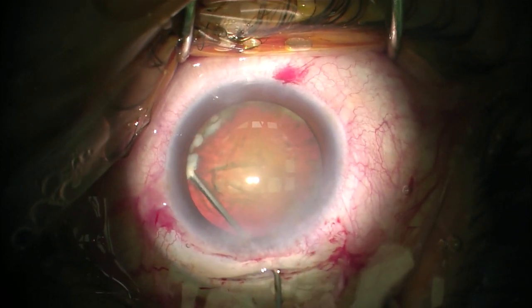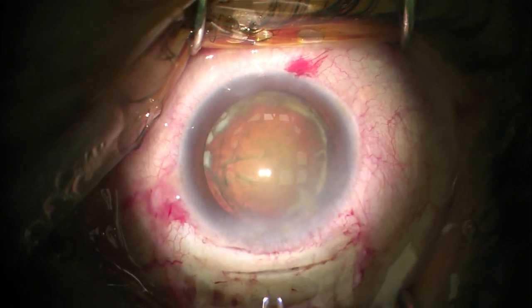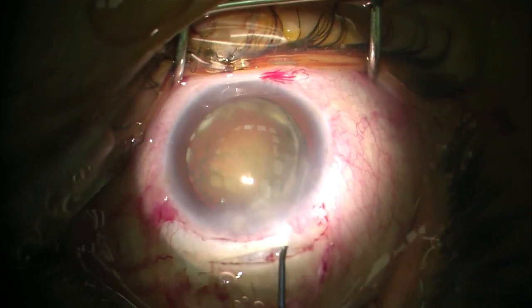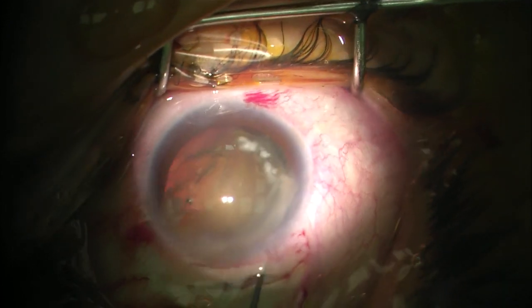Hydrodissection to one side usually gets one pole of the nucleus out. Once you get a pole of the nucleus out of the capsular bag, you start rotating the nucleus from the equator of the lens until it's all out and in the anterior chamber.